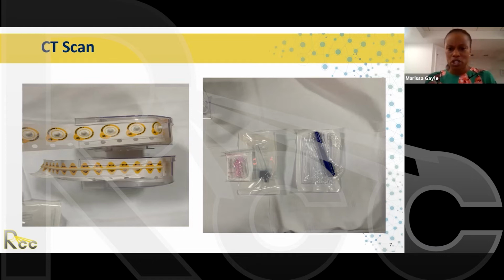And this is just some pictures of the BBs, a picture of the wire. And then in the next picture, we use markers for each and every patient that are disposable. So each patient gets their own marker. Before we start, we like to wipe down the patient's skin with an antiseptic wipe to ensure that once we start marking them and then tattooing, we won't introduce any type of infection to the patient's skin.